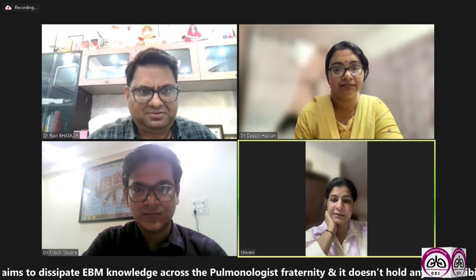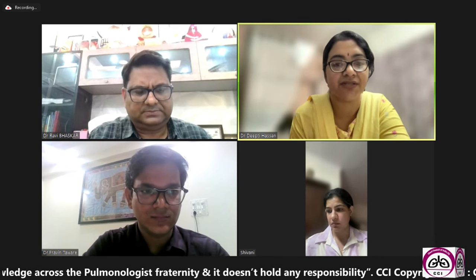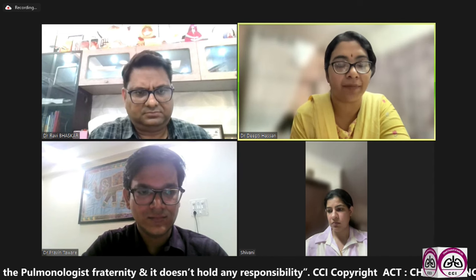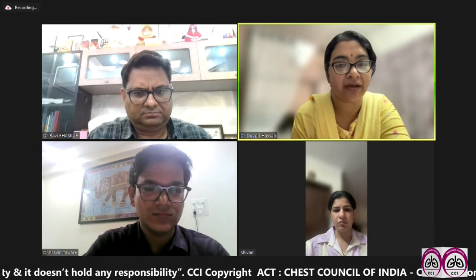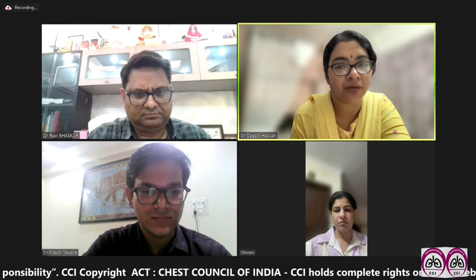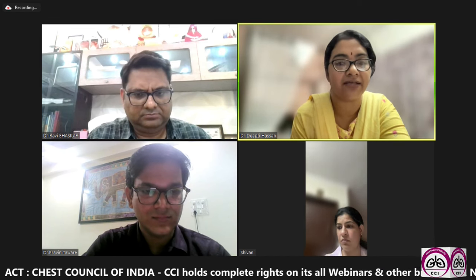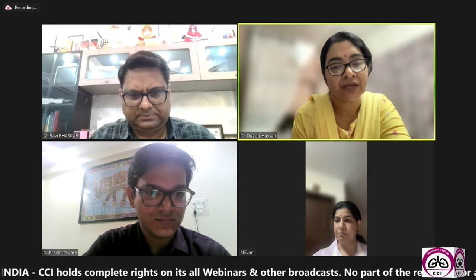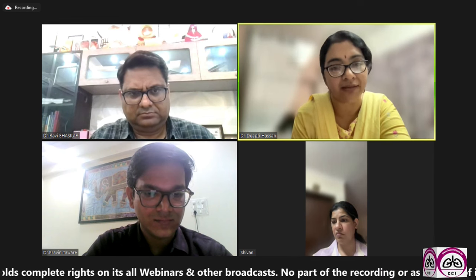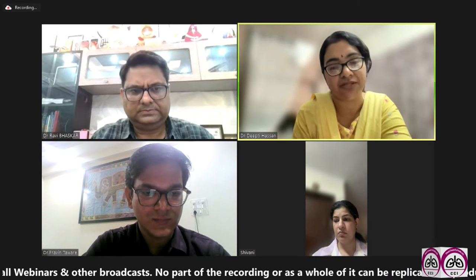I would really request all consultants, pulmonologists and physicians to please follow up their patient about how they are using, how many times they are using. Take a demo every time the patient comes, because the more confident they are about the use, there's a tendency to skip the steps. They may skip the breath holding step. They may skip the gargling step. So it is really important that at every follow-up, a demo of the inhaler device is taken. They are asked whether they are gargling. Are they doing the breath hold? And then also review about any side effects or any other issues they are facing. So every visit, the follow-up about the inhaler device is my take-home message.